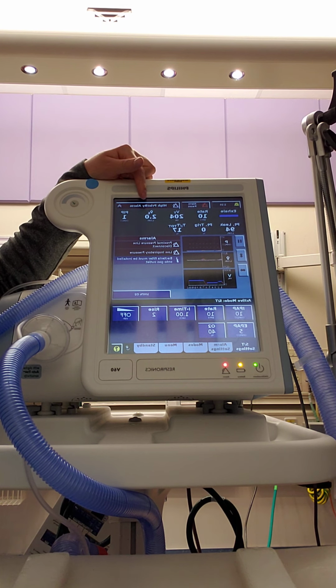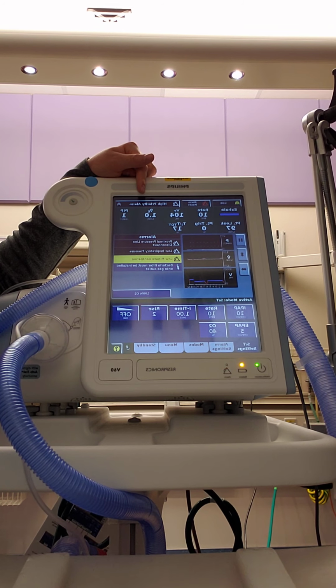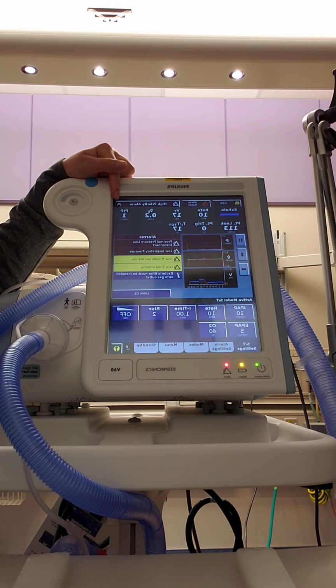This is your minute ventilation. This is the amount you're breathing in 1 minute. So this is much lower. Sorry, I don't have it attached to a patient. So this would be rate times tidal volume, and your tidal volume will be in milliliters. This is your PIP, your peak inspiratory pressure.